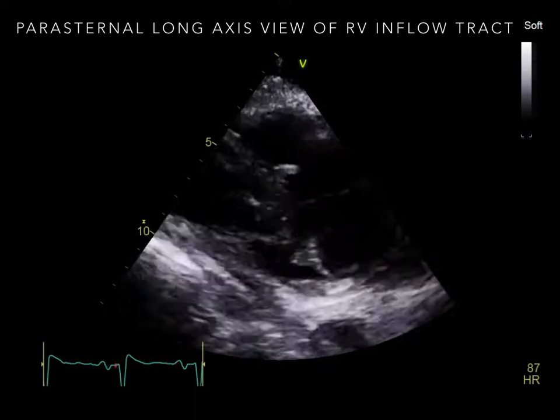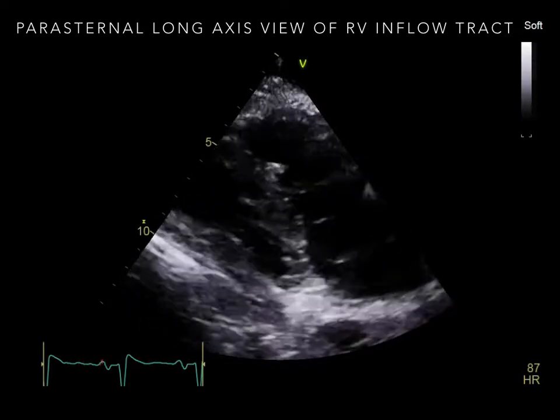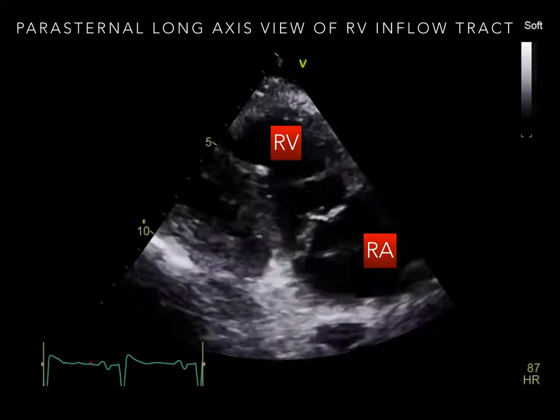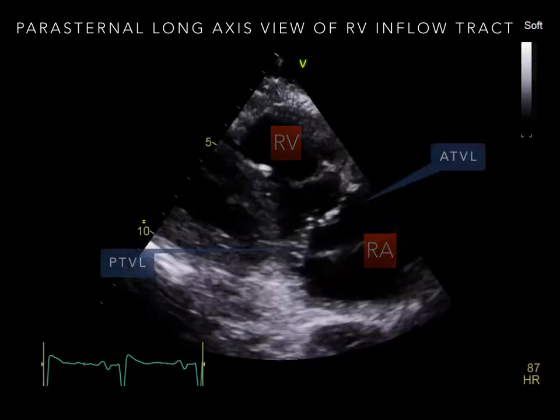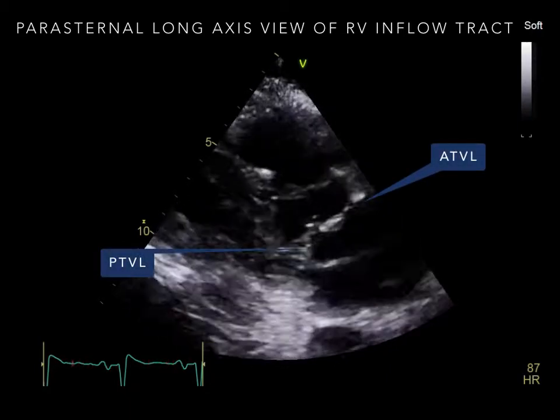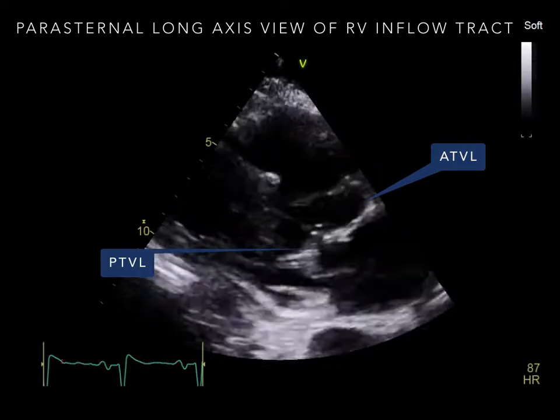Structures identified in the parasternal long axis view of the right ventricular inflow tract are the right ventricle and the right atrium. These are separated by the tricuspid valve. The anterior and posterior leaflets can be visualized from this view.